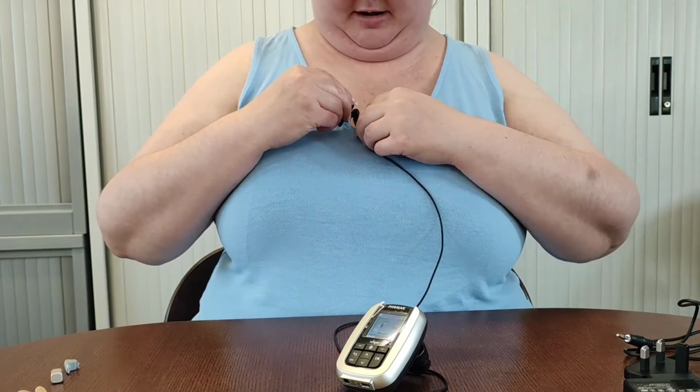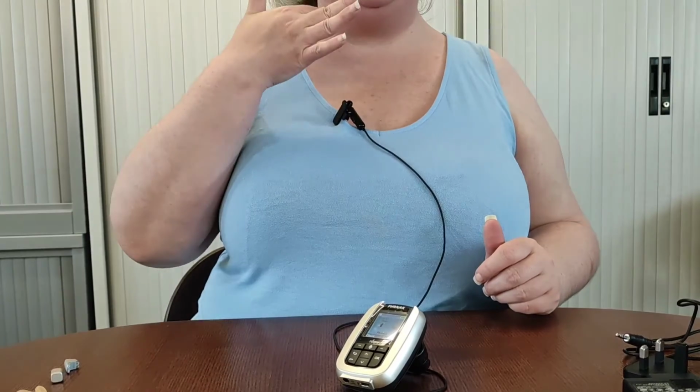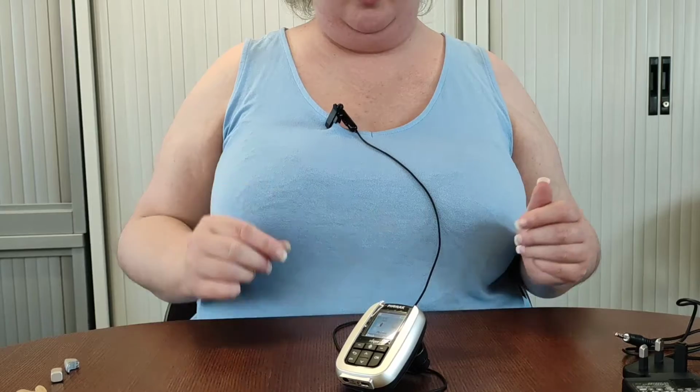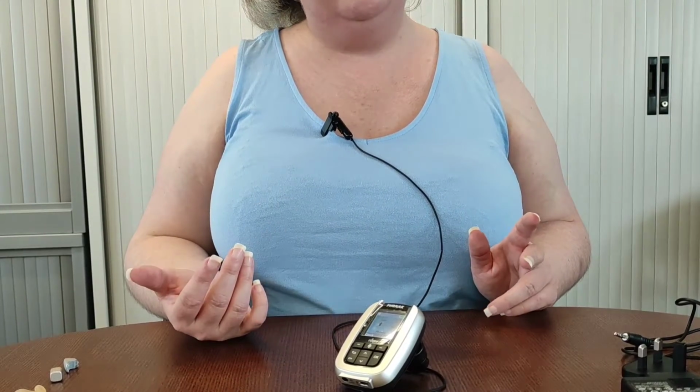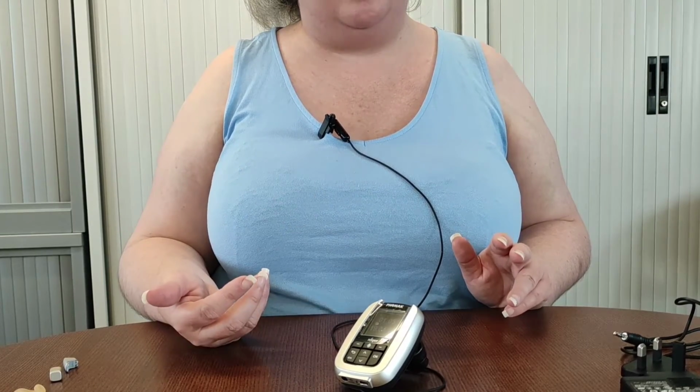Oh, yep, perfect. So we want the microphone facing up towards our mouth. So we don't want it too close because then the person can hear you breathing, and we don't want it too far because then it loses some of that effectiveness that it has.